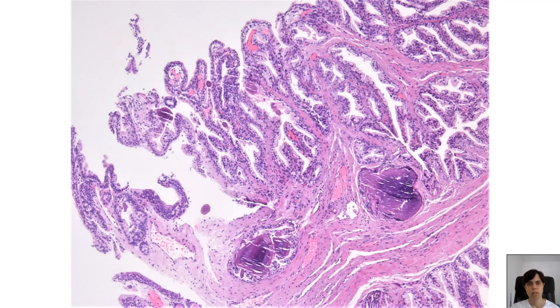On a closer view, we notice there is also some intermixed benign urothelium focally, and we can better appreciate the papillary nature of the lesion — these delicate papillary fronds with thin true fibrovascular cores. Another thing to notice is that there is no significant inflammation in the subjacent stroma.